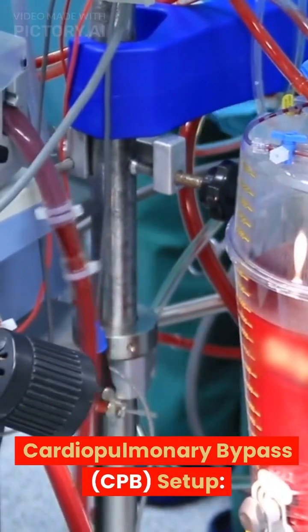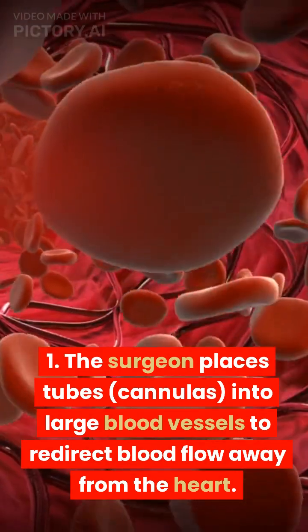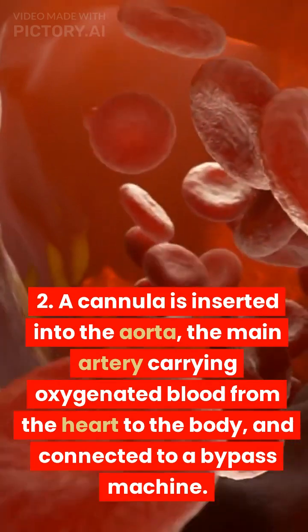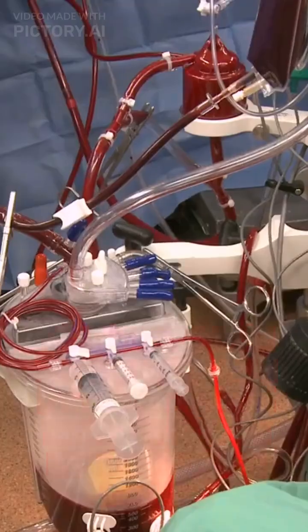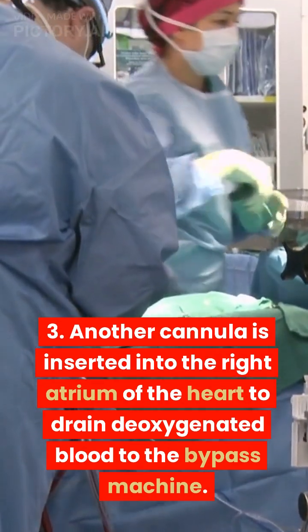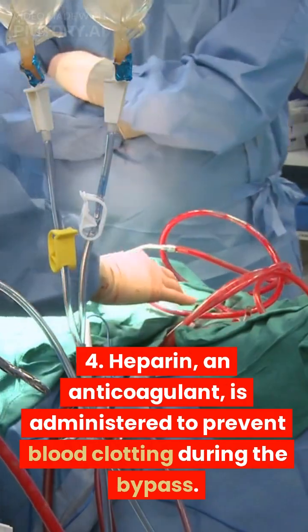Cardiopulmonary bypass, CPB, setup. 1. The surgeon places tubes, cannulas, into large blood vessels to redirect blood flow away from the heart. 2. A cannula is inserted into the aorta, the main artery carrying oxygenated blood from the heart to the body, and connected to a bypass machine. 3. Another cannula is inserted into the right atrium of the heart to drain deoxygenated blood to the bypass machine. 4. Heparin, an anticoagulant, is administered to prevent blood clotting during the bypass.